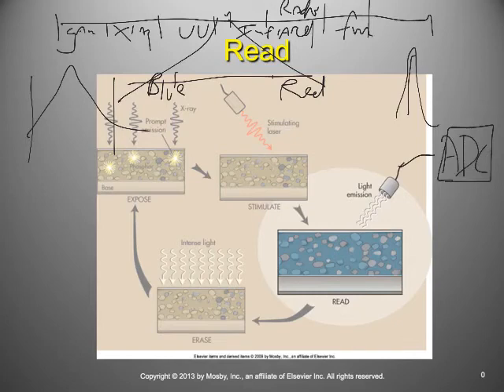Nevertheless, we can lose signal to scatter of light. So I mentioned that the plate itself is turbid. It scatters light in the form of white light. And then we can also have some signal loss to the photodiode of this light, this camera here. It's what we call a photodiode. It's the exact same thing that we were using when, do y'all remember the lab team that made the photometer and measured inverse square law? Inside of the electronic learning lab, there's a photodiode that receives light energy. That's all this thing is.